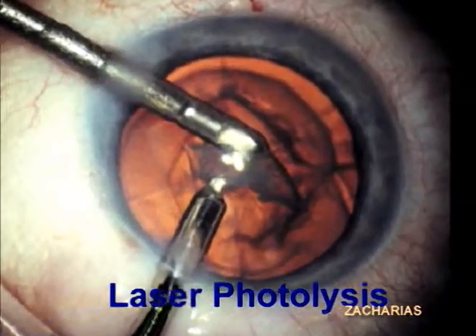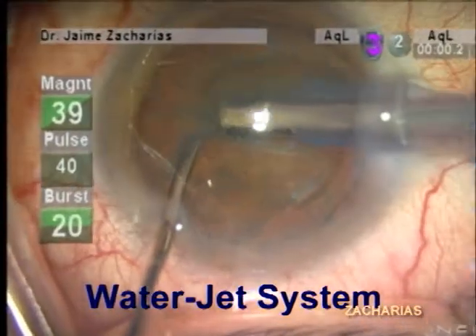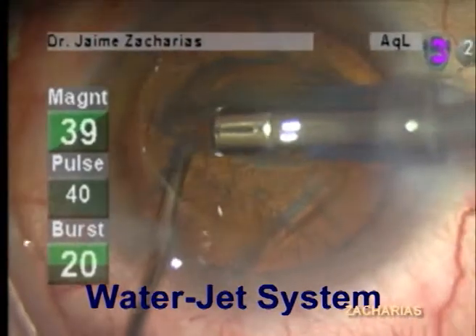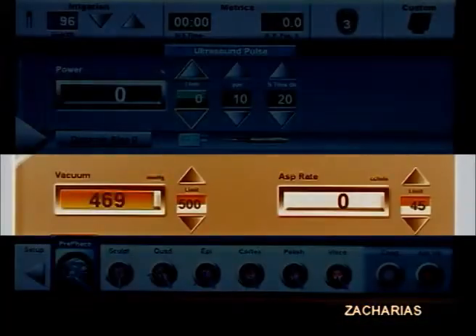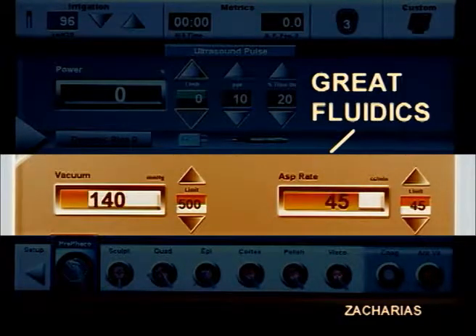Laser photolysis and more recently, waterjet-based lens-removing technologies have been introduced and claim to be capsule-friendly due to the blunt nature of the probe tip. Unfortunately, all these systems are less efficient than ultrasonic-based systems, being unable to adequately handle hard cataracts. In fact, most of their lens-removing capabilities may derive from the greatly enhanced fluidics of the modern consoles.